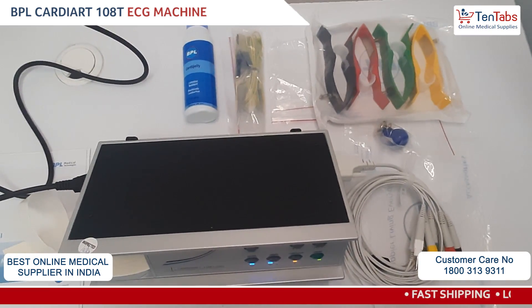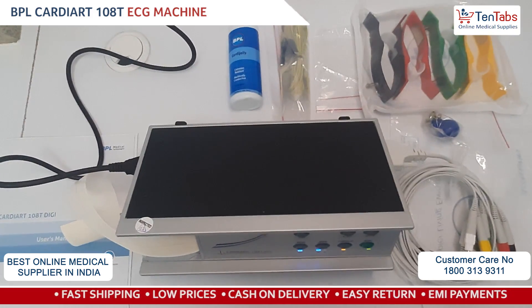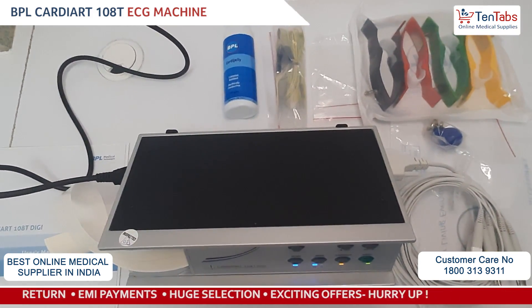So guys, this is all for the unboxing and installation of the BPL 108 Digi single channel ECG machine. Thank you.